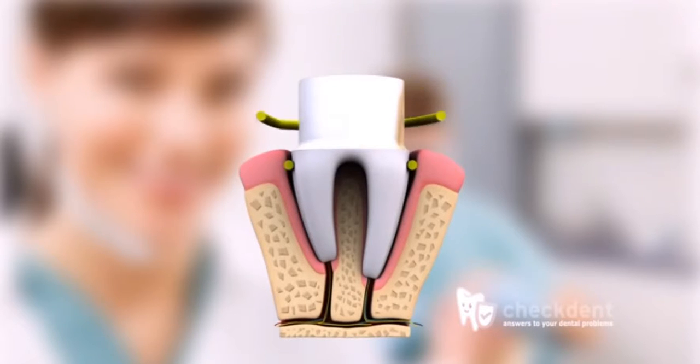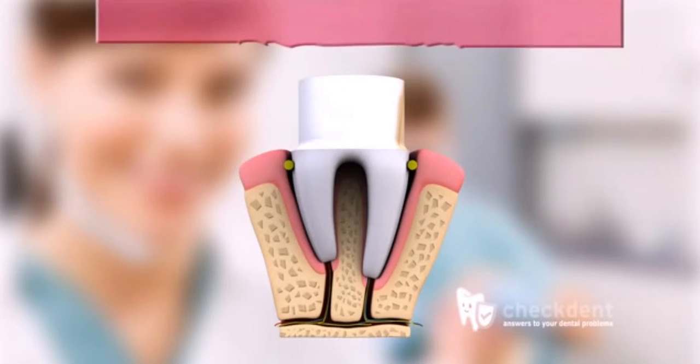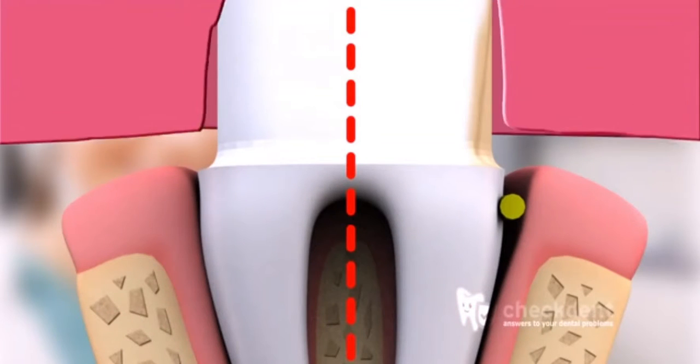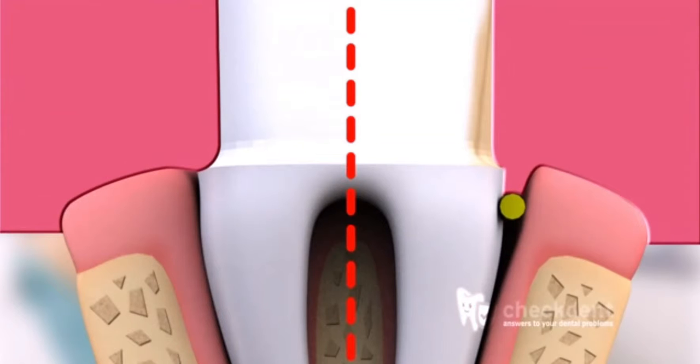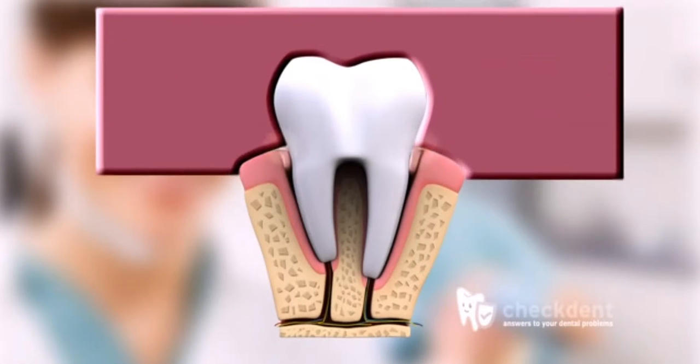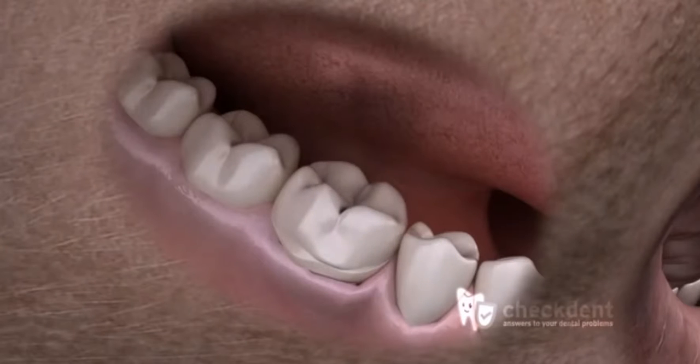By laying the second gingival retraction cord, the gums are deflected in the other direction. When the second gingival retraction cord is removed just before the impression is taken, the impression material will clearly record the preparation margins. On the right of this animation, the preparation margin is clearly visible. On the left, the consequences of not using ligatures can be seen. The plaster mold does not correspond to the prepared tooth, as the impression material has not recorded the preparation margins. This could be because of the presence of interfering gingiva and/or blood or saliva. The technician will unknowingly prepare an ill-fitting crown.